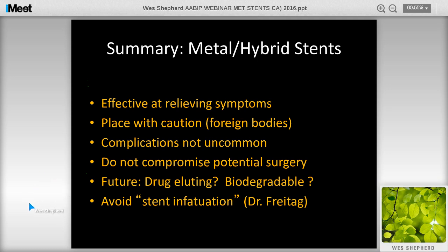And we have some questions from the audience typed in. So first from Mel Imad. He says, thanks, Wes, for this presentation. When placing Ultraflex by rigid, do you prefer distal release or proximal release, and why?